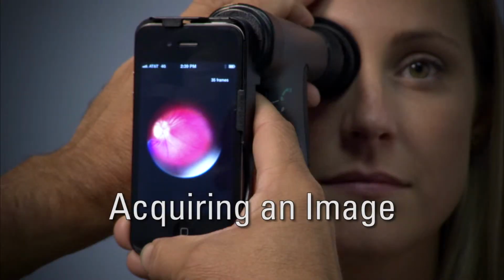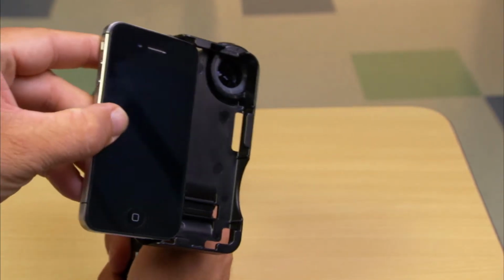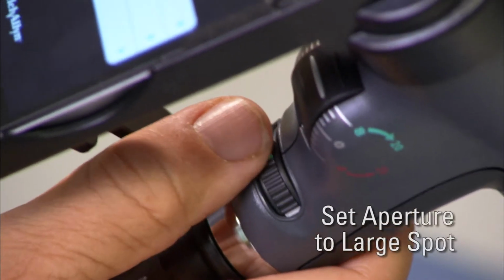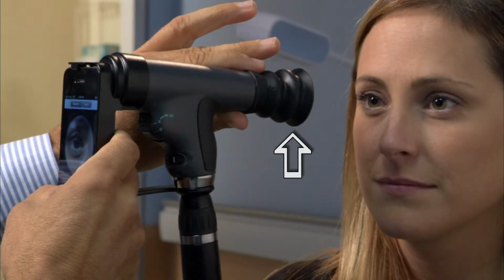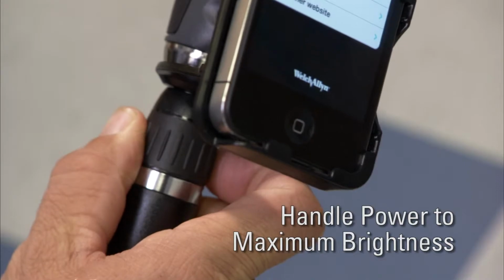The following procedures are intended to guide you as you learn to use the iExaminer. First, attach your iPhone to the panoptic according to assembly instructions. Set the focus wheel on 0. Set aperture size on the large spot. Ensure the eye cup is secured firmly on the patient's side of the scope. Turn handle power to maximum brightness.